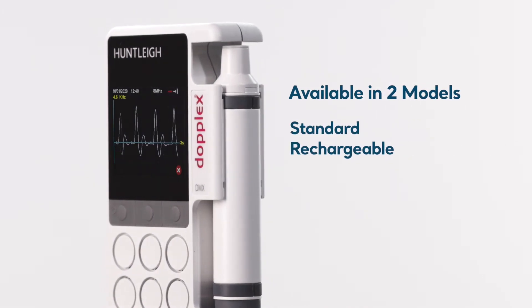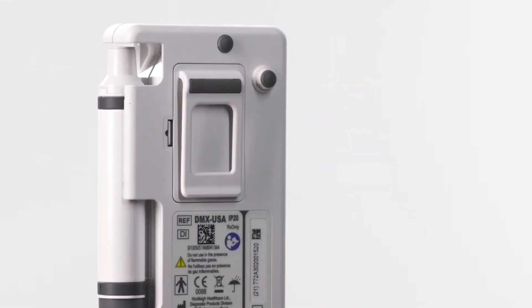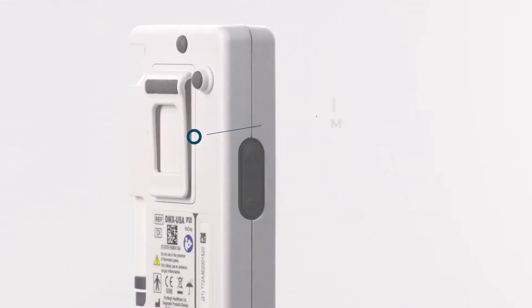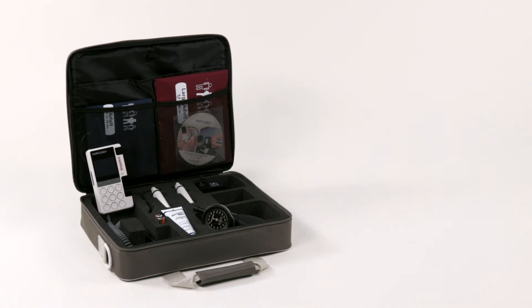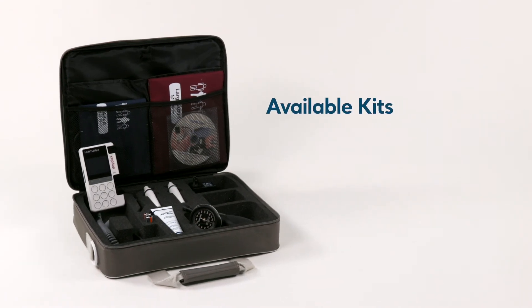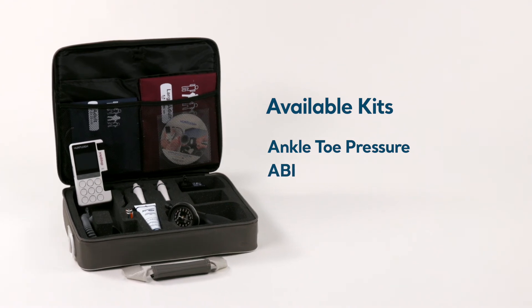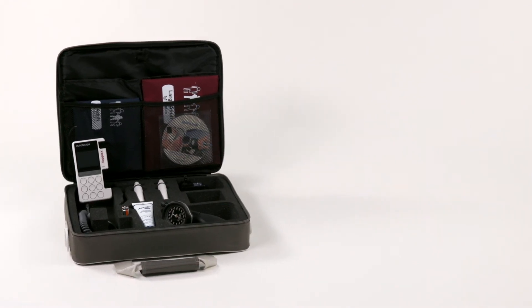The DMX can be purchased as a standard or rechargeable battery model. Both models allow storage of sounds and waveforms on the included micro SD card. The DMX is available in kit form for the convenience of having all the necessary components, including the ankle-toe pressure kit for assessment of the diabetic foot, and ABI for measurement of the ankle brachial index.